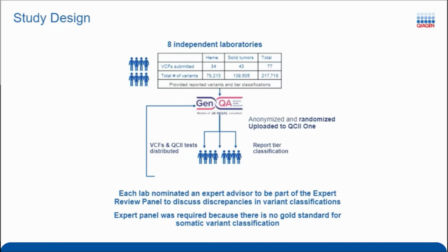Yeah, thanks, Jim. We had a perfect example of that in the study as well, because we did have some VCFs that had thousands of variants in them, and this was a source of discordance. But when we looked at those variants, they were all around about the same variant allele frequency, which was less than 10%.